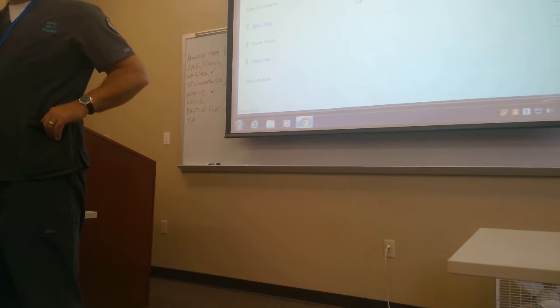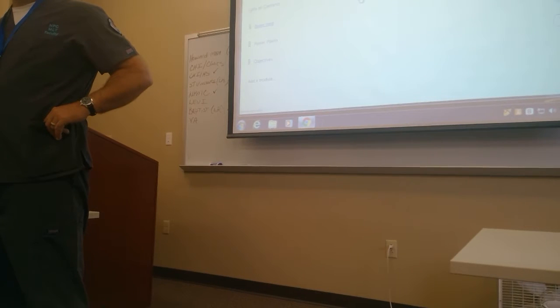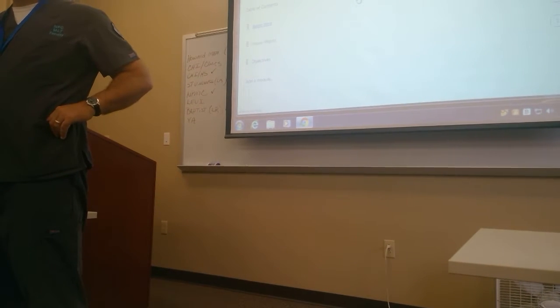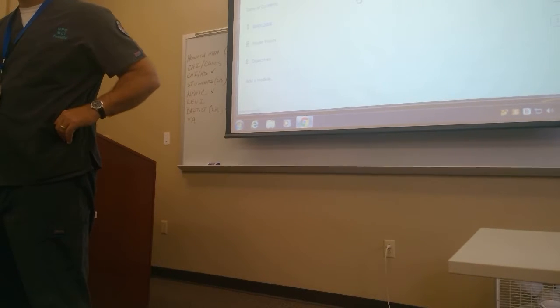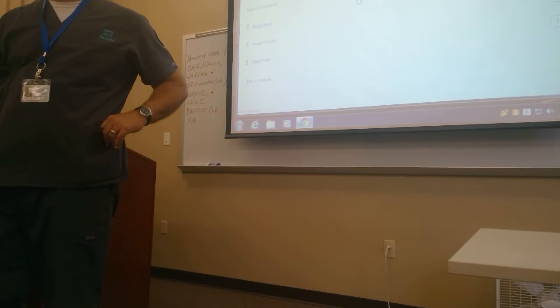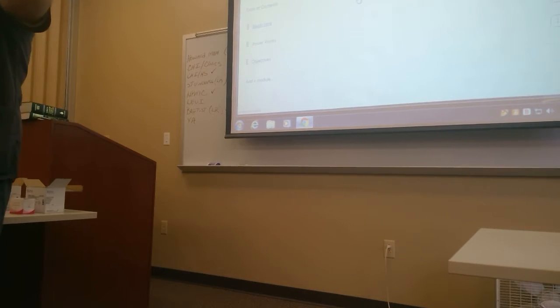In other words, your normal has to have normal results, and your abnormal has to have abnormal results. It doesn't have to be dead on accurate, but it has to be within the ranges for you to accept that quality control run. Once those work, you can run patient specimens for the next 24 hours. Yeah, Darren? These controls in these kits, they represent what we refer to as external QC. Yep, external QC. Now let's talk about internal QC.